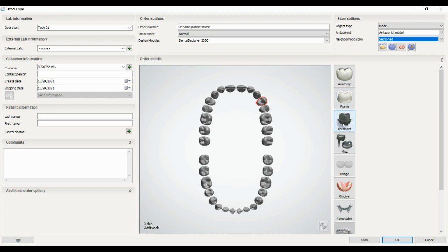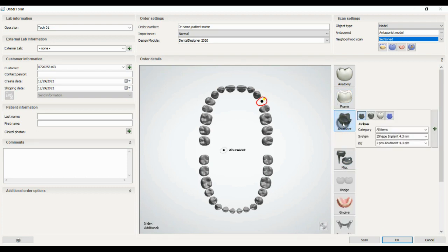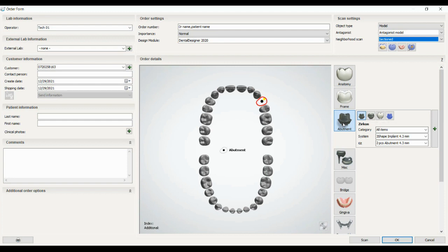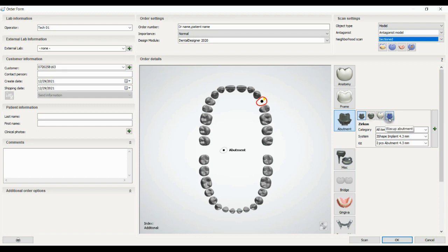The next option is abutments that we can use for designing custom abutments. The type subjects are customized abutment, anatomical abutment that has cusps, and you can design telescopic and post-anchor. It could be a retained crown that is a one-piece abutment, and wax abutment.